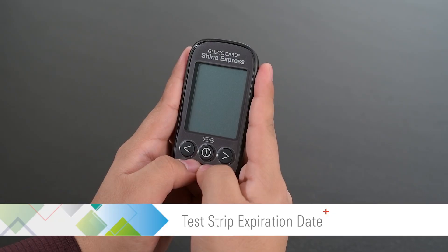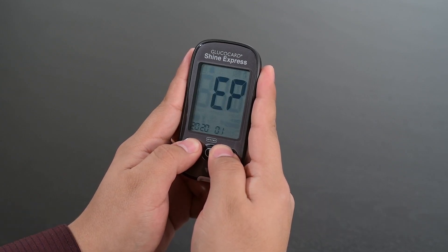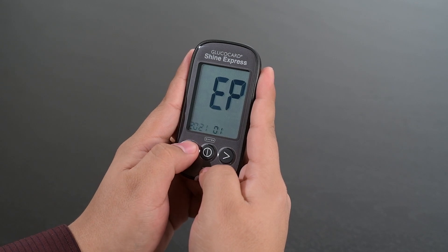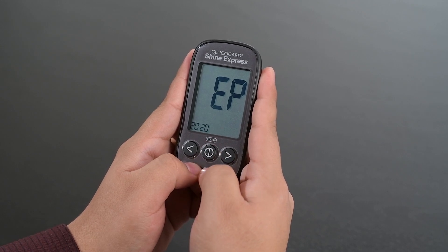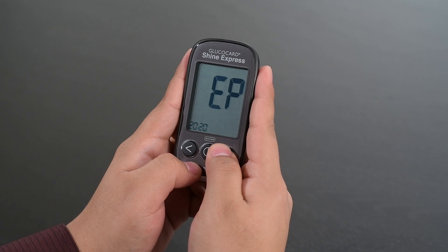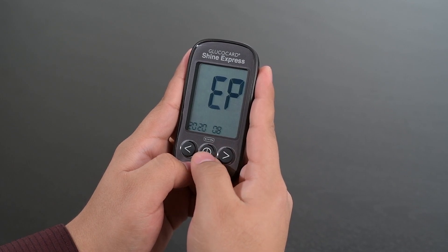If the test strip expiration date indicator was set to 'On', press the left and right arrow at the same time for 3 seconds. Use the left or right arrow button to set the test strip expiration year. Once the correct expiration year is displayed, press the center button. Now use the left or right arrow button to set the test strip expiration month. Once the correct expiration month is displayed, press and hold the center button for 3 seconds to save the expiration date.